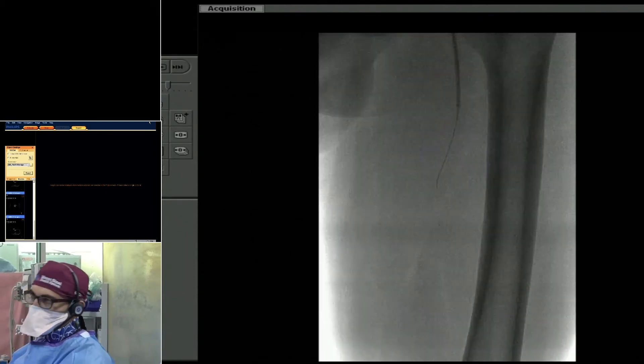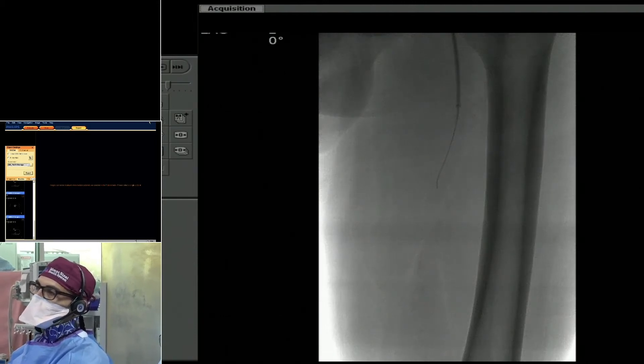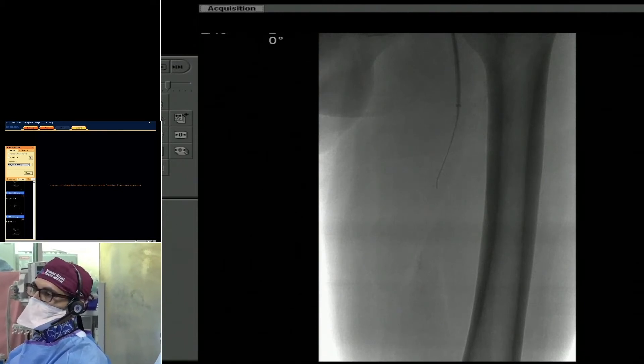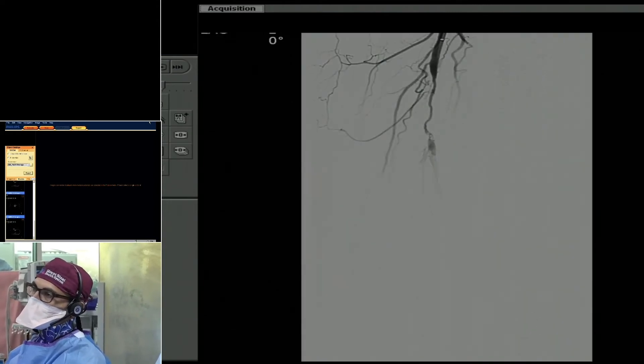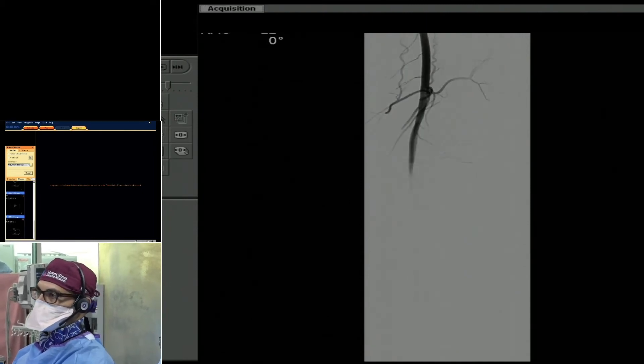You get a hint that the anterior tibial, posterior tibial, and peroneal are all filling. We went ahead and placed our 5-6 French slender Kurumo destination sheath — a 119-centimeter sheath — and then subsequently used the CSI ViperCross CX crossing catheter, which is 200 centimeters in length, to cross the lesion.